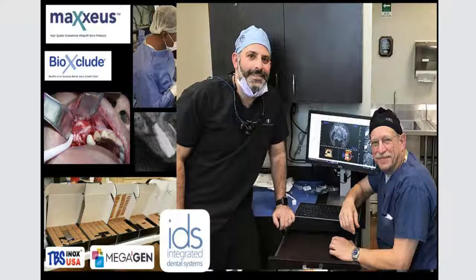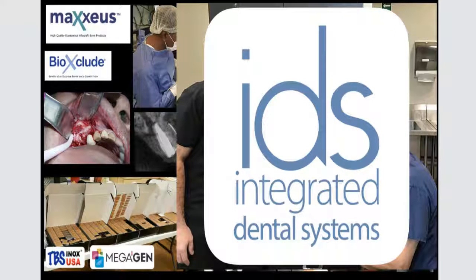My partner and dear friend, Dr. Isaac Towell, co-director of Advanced Implant Education, and here we are, of course, in front of the computer looking at a cone beam CT planning for a case that we are going to be doing with one of our student clinicians. And so everything is based upon a proper 3D evaluation for every single patient that we work on.